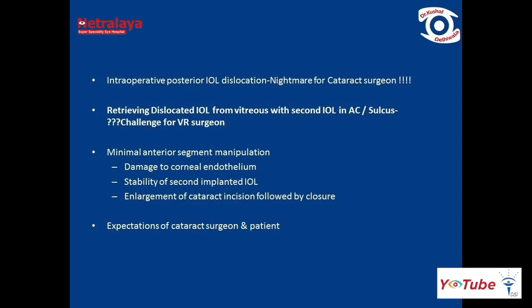Intraoperative posterior IOL dislocation can be a nightmare for a cataract surgeon, but retrieving a dislocated IOL from the vitreous with a second IOL implanted in the anterior chamber or sulcus can be a challenge for the vitreoretinal surgeon, keeping in mind minimal anterior segment manipulation, possible related complications, and above all, the expectations of the cataract surgeon and patient.